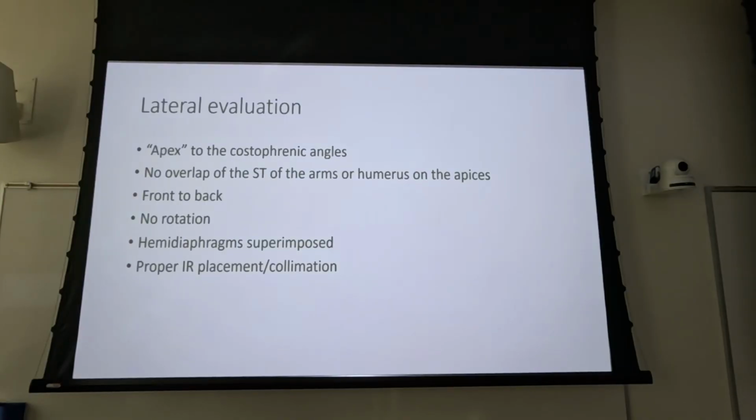If they took up the entire 17-inch length, pretty much, and you got from the apex as far down as you could get, but they breathed themselves off the image receptor laterally. Repeat. You didn't include all the anatomy, but what would you do? You missed both sides. There you go. So you essentially just shoot for that lower end, right? You take your image receptor out, you put it in crosswise, you're not going to fit them on there crosswise either. But what you could do is just shoot the bottom side just to make sure that you got everything, right? So understand limitations of your equipment and what it is exactly you need to shoot.